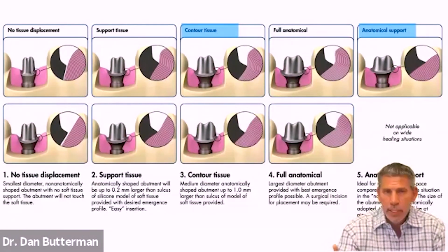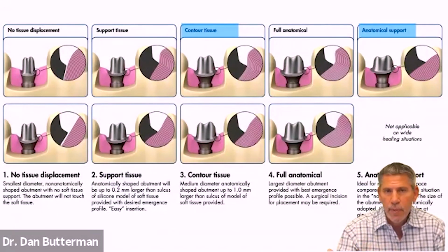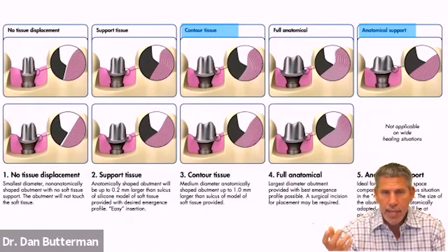The problem with milling is that you can only mill it with one guide hole. For the equipment, the Primemill and the MCXLs that we have access to on the CEREC side, you can only mill one guide hole. So if I need multiple guide holes, then I do need to print it. And those can be incredibly accurate.